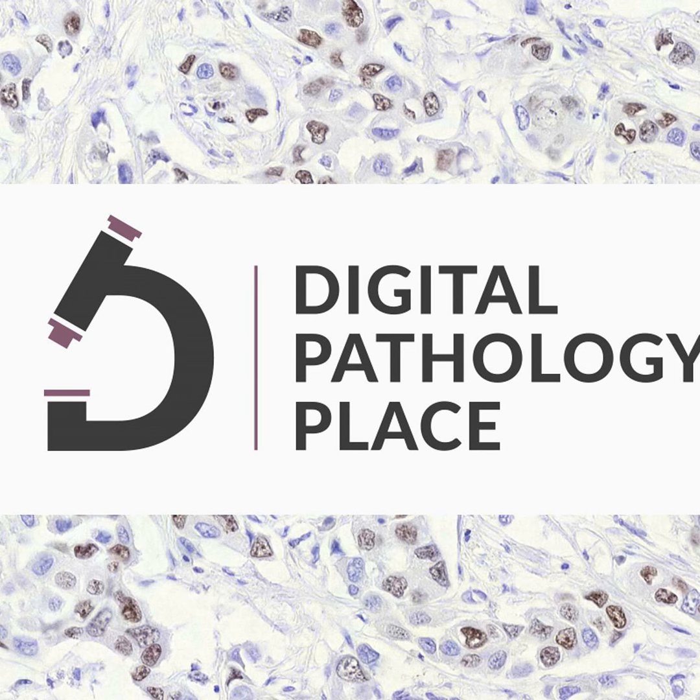Digital pathology also finds extensive application in cytopathology, which deals with the examination of cells to detect diseases. Digitization of cytology specimens, such as pap smears or fine needle aspiration samples, enables pathologists to navigate easily through different planes of the specimen, zoom in for detailed analysis, and utilize image analysis algorithms to detect subtle changes indicative of disease. By augmenting the traditional microscope-based diagnosis, digital cytopathology enhances diagnostic confidence and efficiency, contributing substantially to improved patient care.